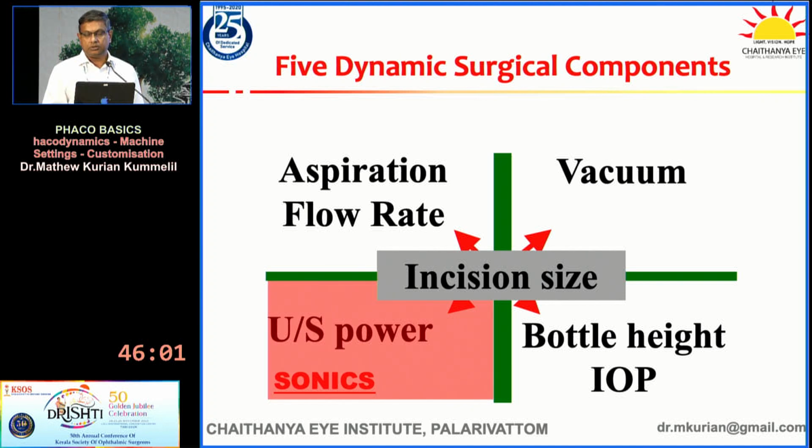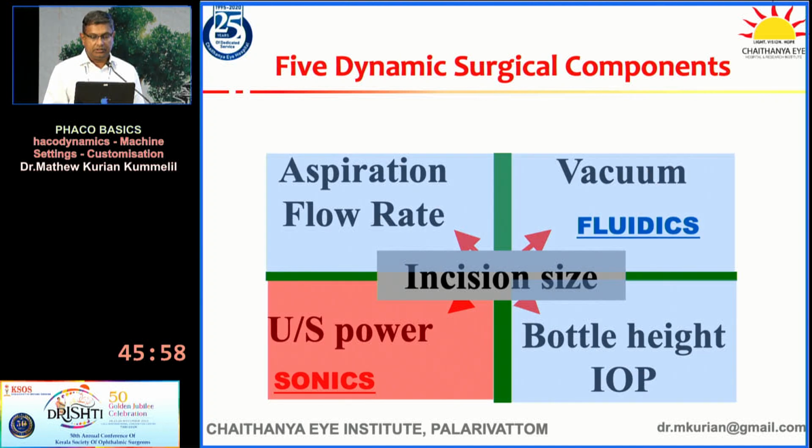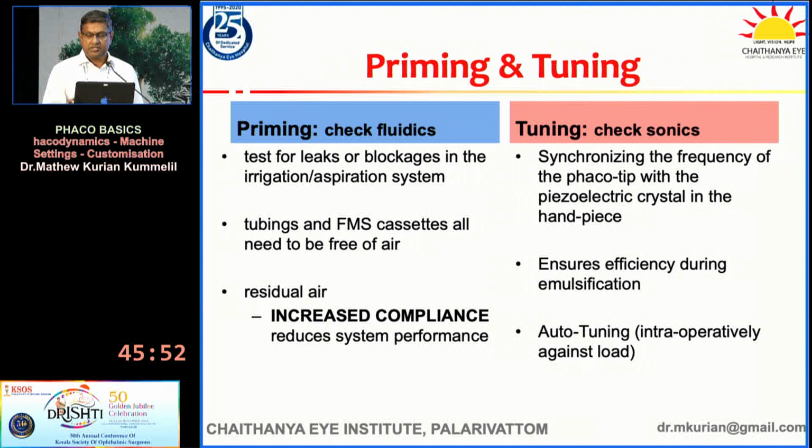The ultrasound power, sonics, generates the heat, and the rest of it is to cool down and prevent corneal wound burns. The first step, of course, before we start anything is priming and tuning, which often we don't do. The staff will be doing it for us, but we need to understand what they do. Priming is to check the fluidics, and tuning is to check the sonics of the Phaco tip.